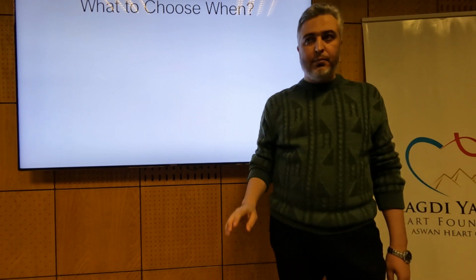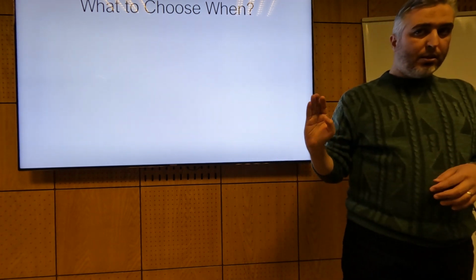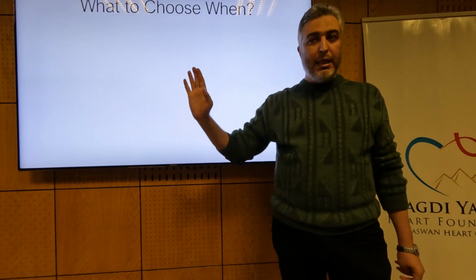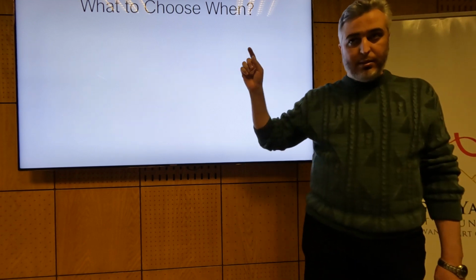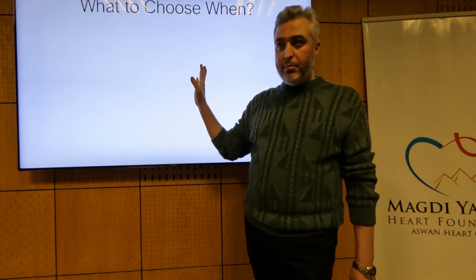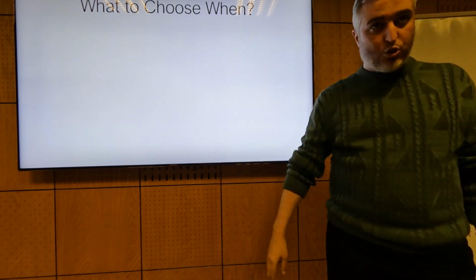DDI is quite useful as a backup mode, yet can lead to unnecessary ventricular pacing and, in some scenarios, to AV dissociation. DDD is quite a smart mode, yet can be dangerous in atrial arrhythmia and can sometimes lead to unnecessary ventricular pacing, but it guarantees AV association, AV sync.